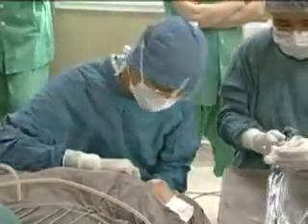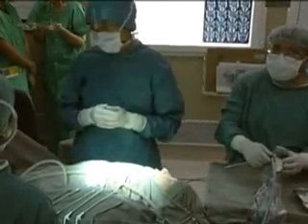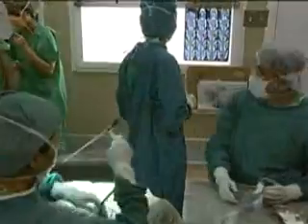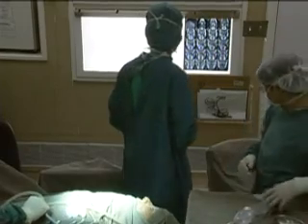Okay. So I would like now to try a canine fossa sinoscopy, to see if we have further additional information. But when you do that, what area do you think you haven't seen? I think I have seen all the content already. So why do you need to do the canine fossa in that case? Just to be safe, in case I miss something. Let's have a look at the CT scans again for the audience if we can.